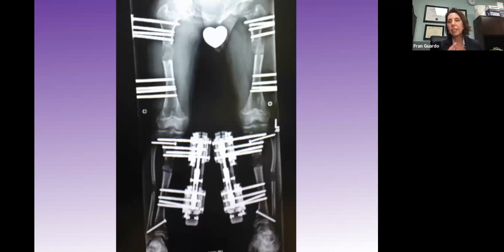We took a second to talk about the nerves. Our doctors do the rail system, the Vilex or the modular rail, on the medial side of the lower leg, sorry, to avoid any complications with the peroneal nerve. So that is why you see those on the inside. We want to stay away from that peroneal nerve on the lateral side.